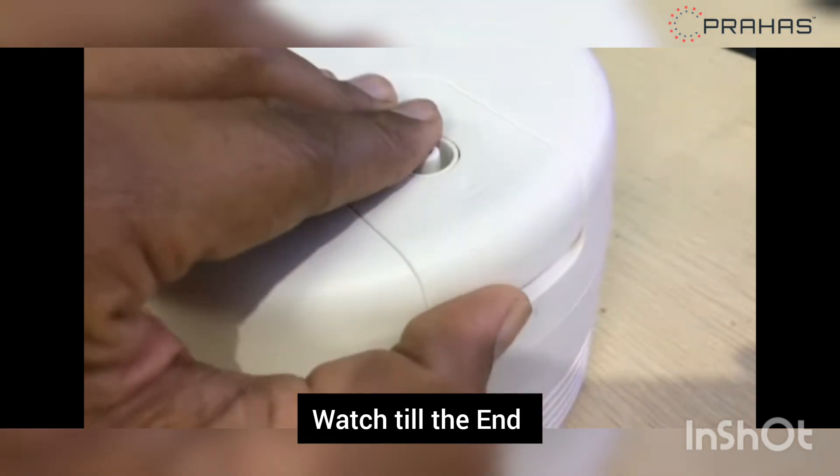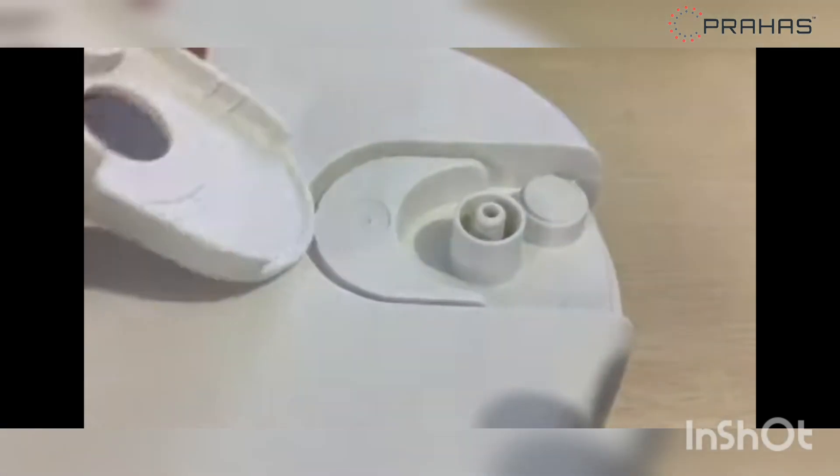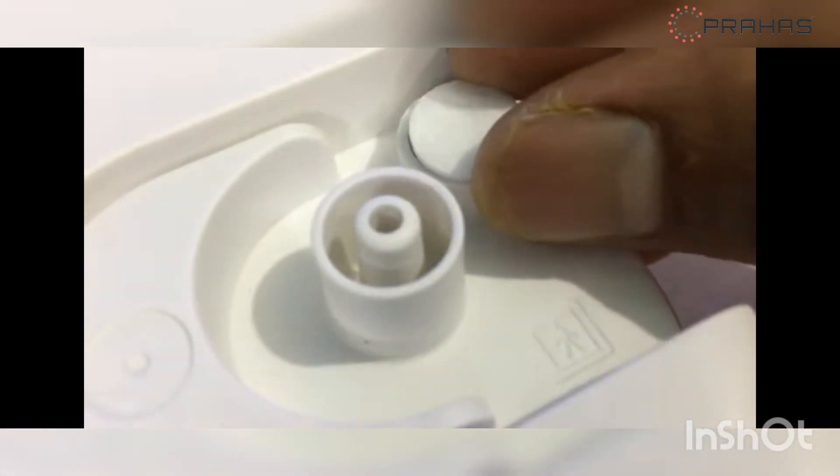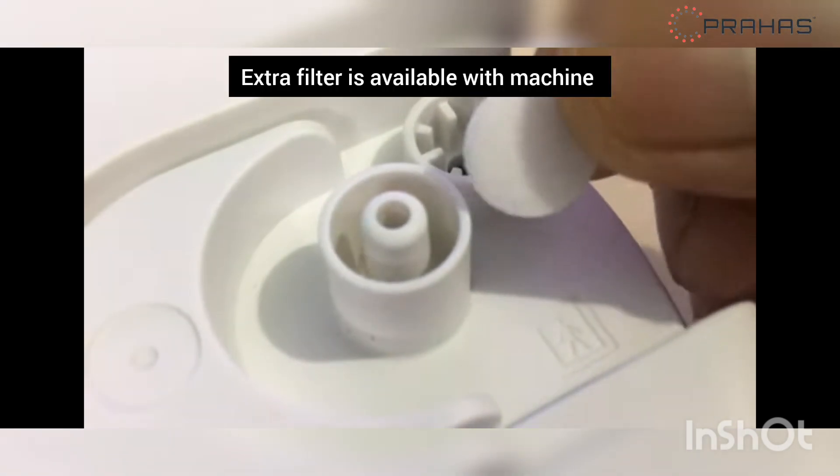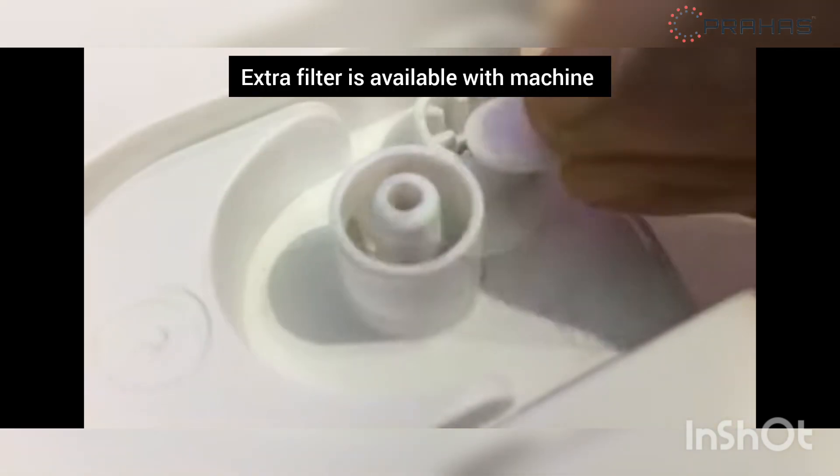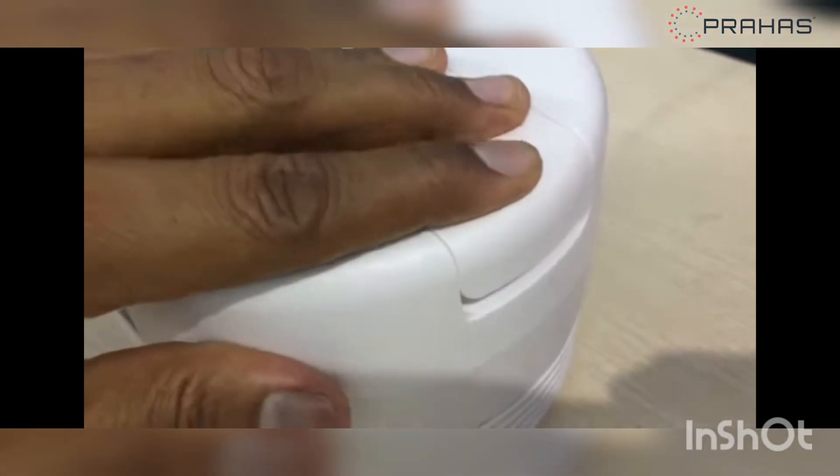To check the filter remove cover by pulling it up. Remove filter and check if it's free of dust and not wet. Remember filter cannot be cleaned and good to replace if used for more than 60 days.